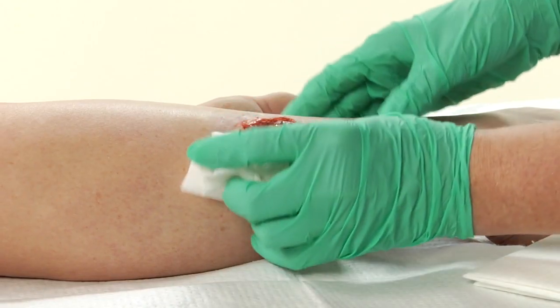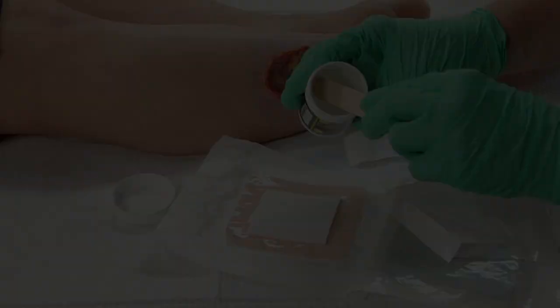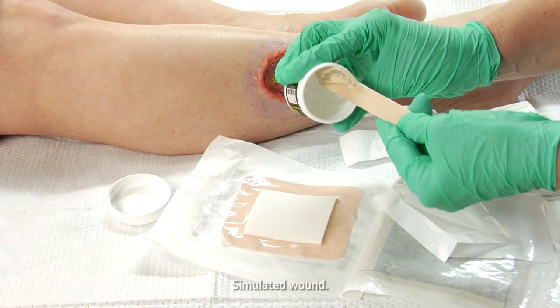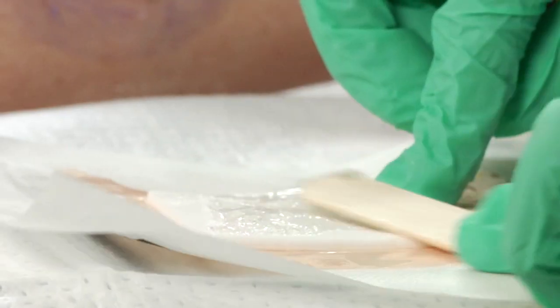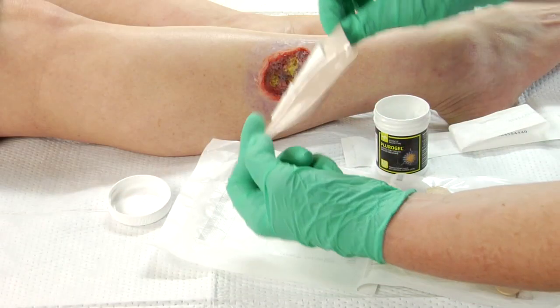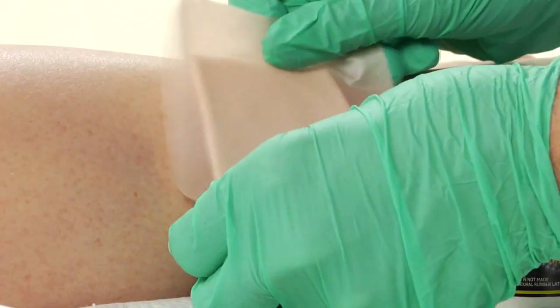Cleanse the burn or wound according to normal procedures. Apply the product directly onto the sterile absorbent secondary dressing of your choice using an applicator such as a tongue depressor. Place the dressing directly onto the wound and secure in place.